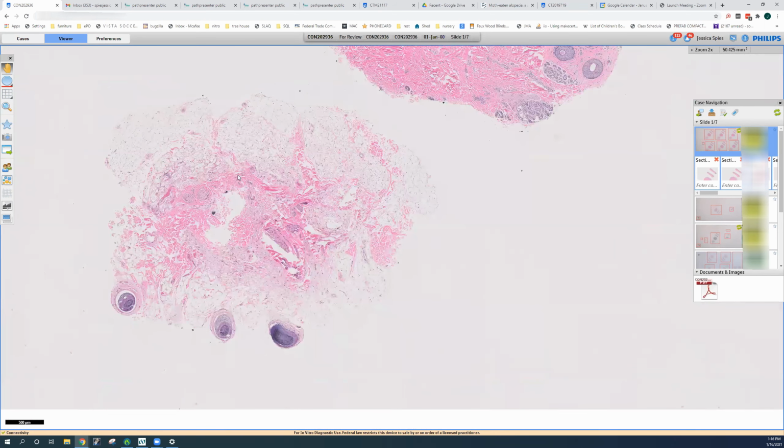Other things to notice in this biopsy: we have a kind of patchy lymphoplasmacytic infiltrate. Let's go a little bit closer. Let's see, this is a little bit blurry. Is there a better section to see this? Here, actually, we can see that the majority of these inflammatory cells are plasma cells. They're the cells with this eccentric nucleus and perinuclear hof. That's where the immunoglobulin is stored.